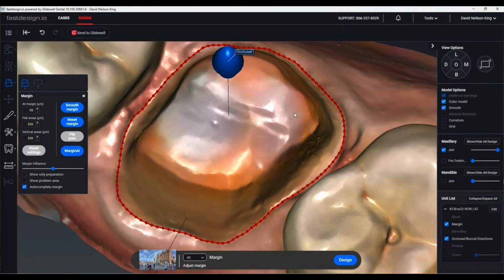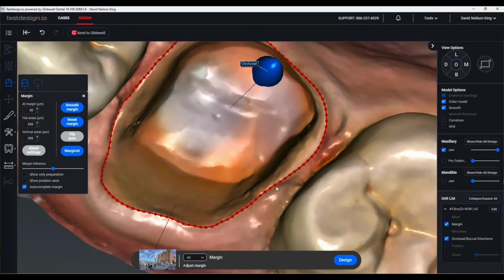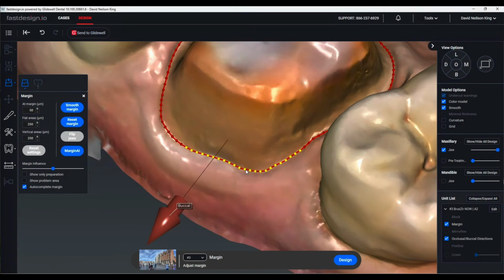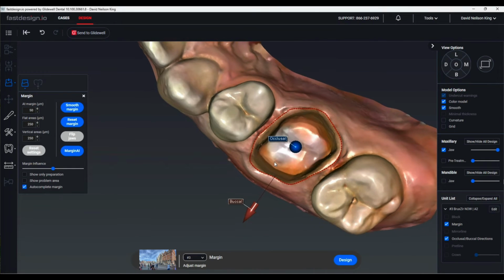I learned early on in my digital design career that when in doubt, take it out. You'd rather have a margin that's a little too wide than a little too narrow. So I'm going to make that just a little bit wider here. I know we may be slightly outside the margin in a couple of places, but if you're ever in doubt, take it out. Okay, we're going to check our path of insertion. Occlusal looks good, buccal looks pretty good. I'm going to move that just a smidge, and then we're going to hit Design.